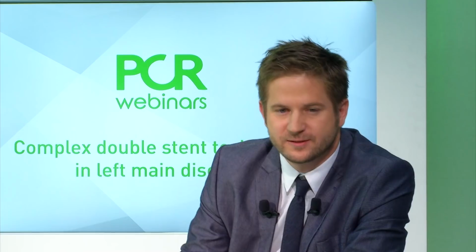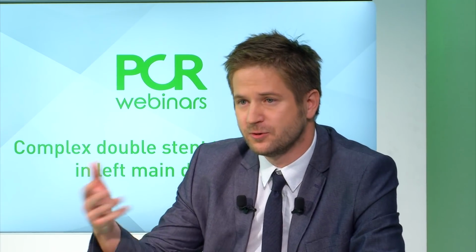So thanks for this presentation. Before you give us the solution for this case, I would like to ask Chris again, when you are facing this patient in your cath lab, what is your next step? Is it to do PCI right here, right now, discuss with surgeons, send for surgery, or plan it for a second procedure?